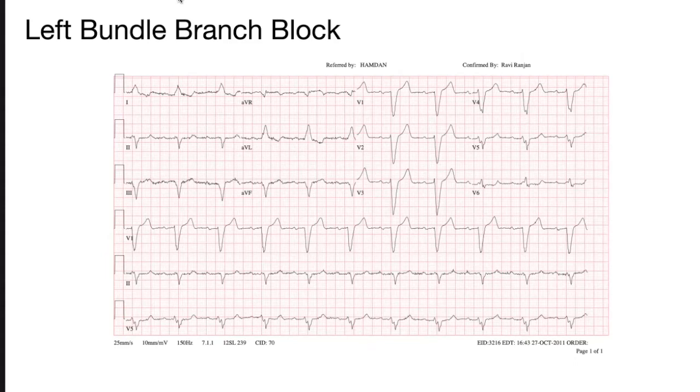So now look up there. In that QRS for V1, you can't even see the right ventricle activating because the left ventricle is just so huge and slow and taking up the whole wavefront. It's all negative all the time. In theory, we'd expect a little positive bump as it comes over to the right side, but that happens so fast and it's so small compared to what the left ventricle is doing that you can't even see it.